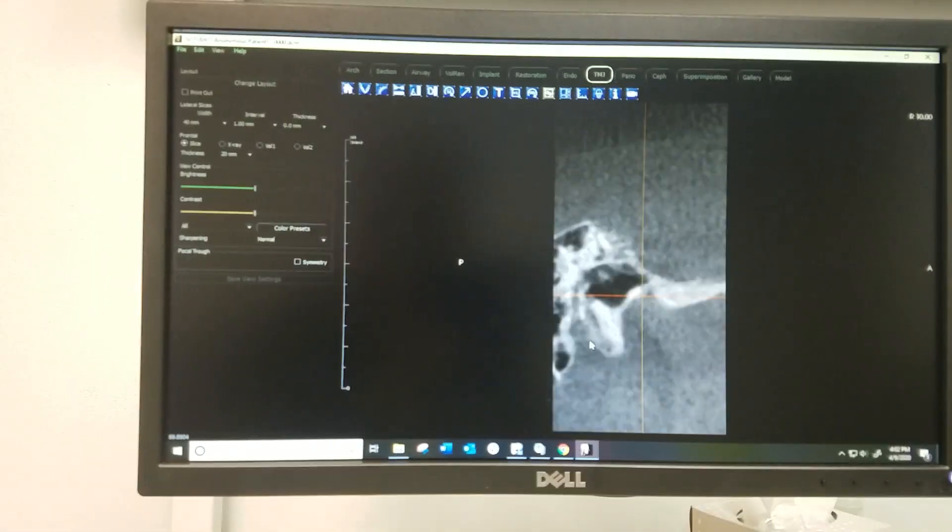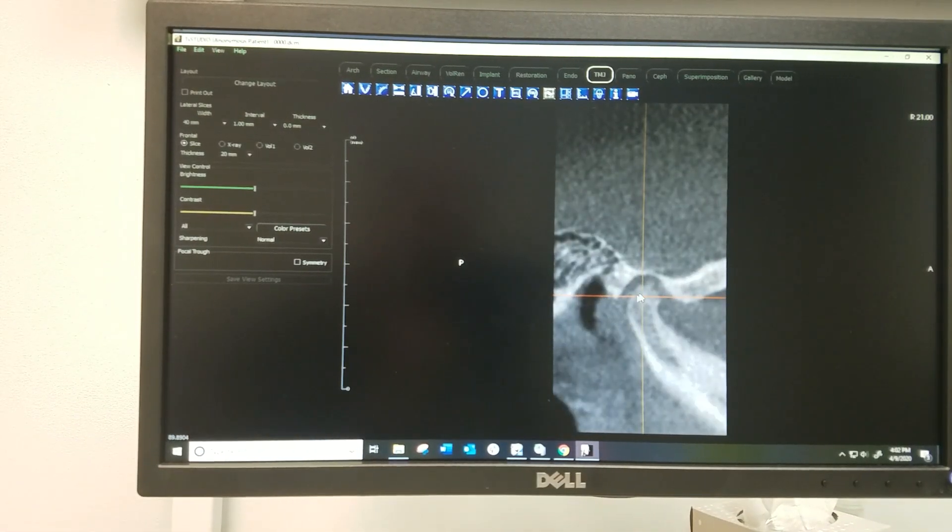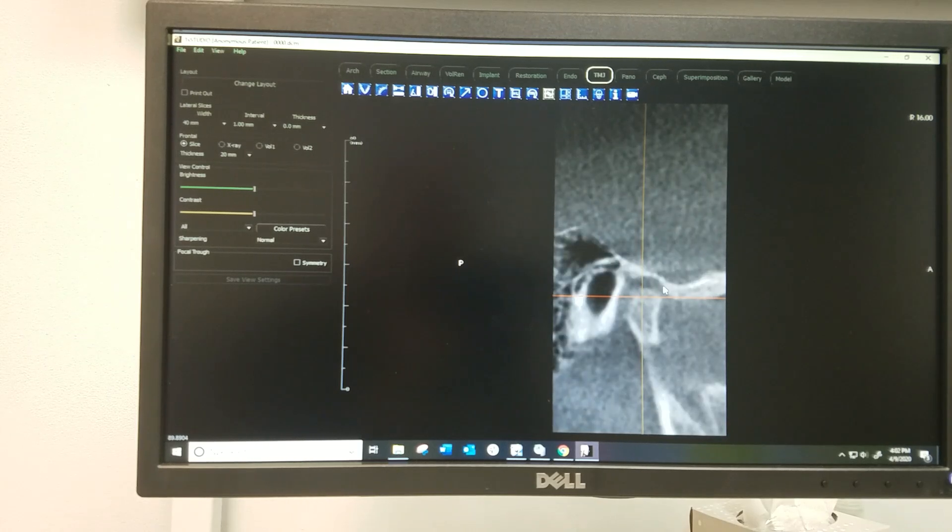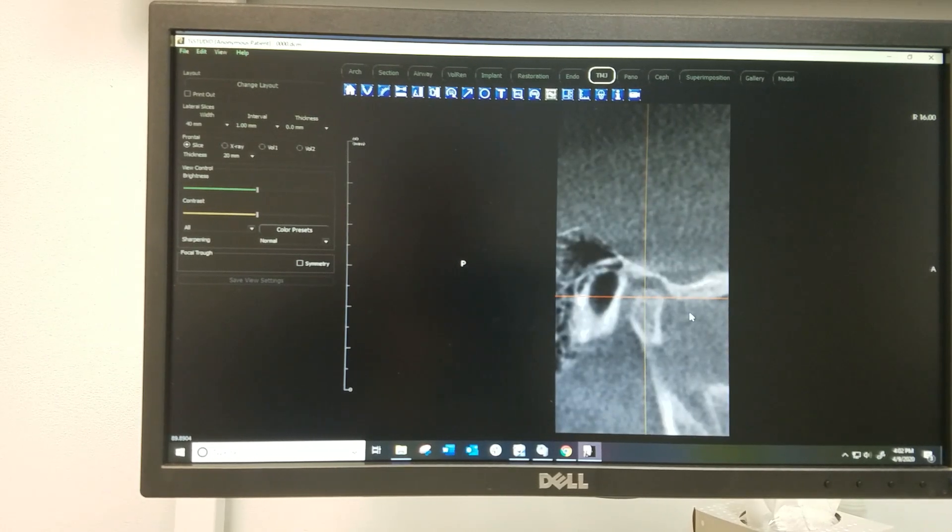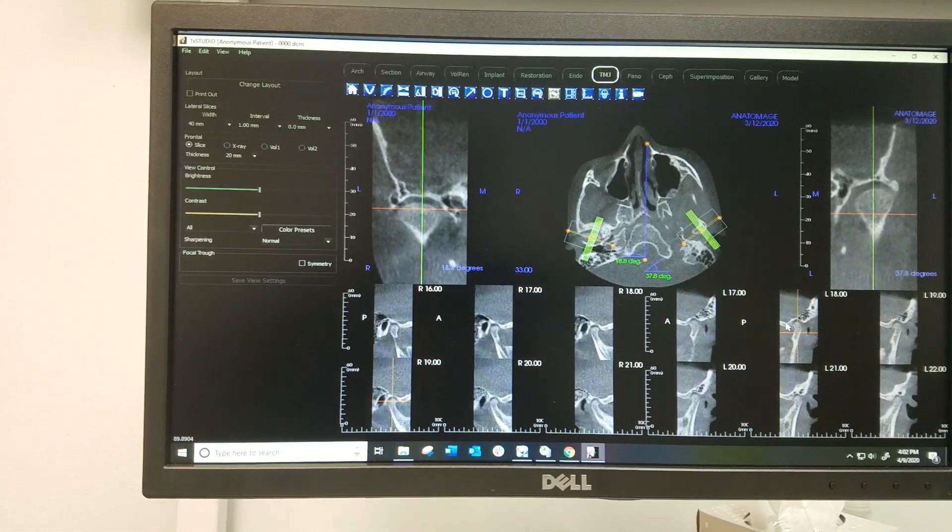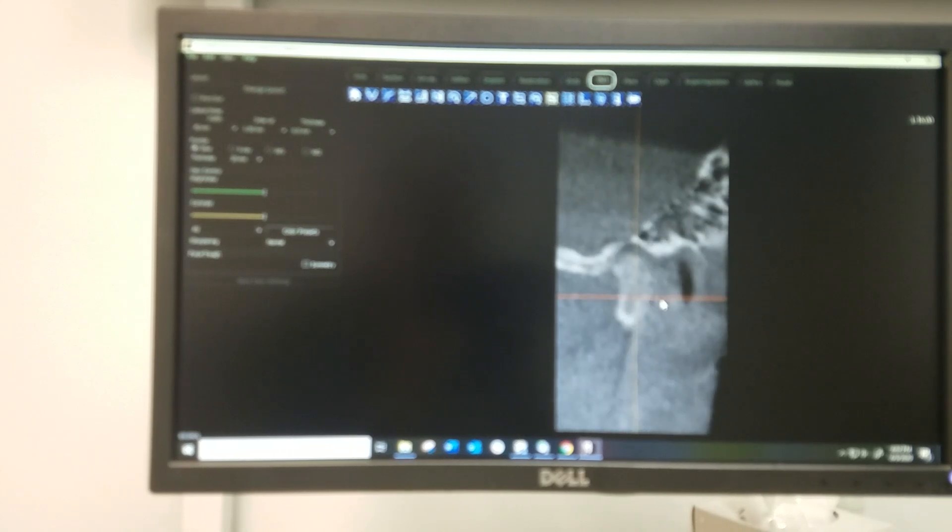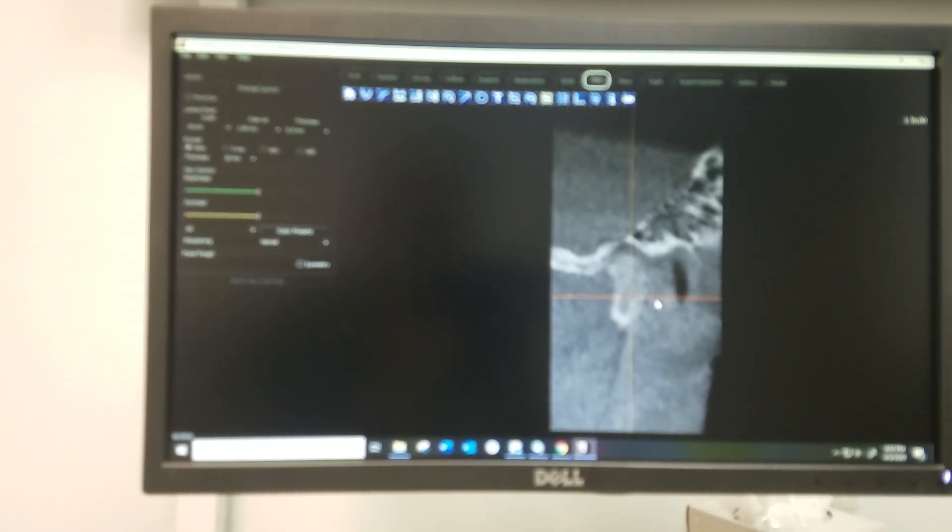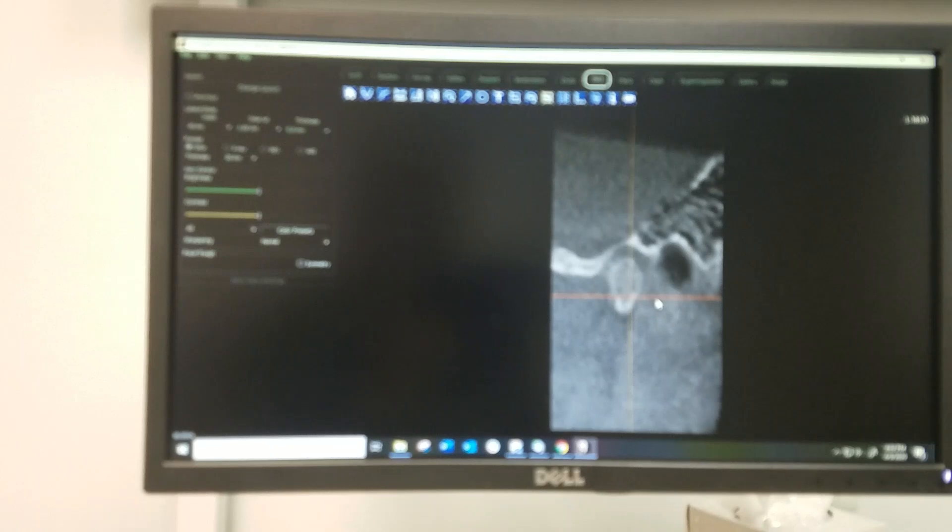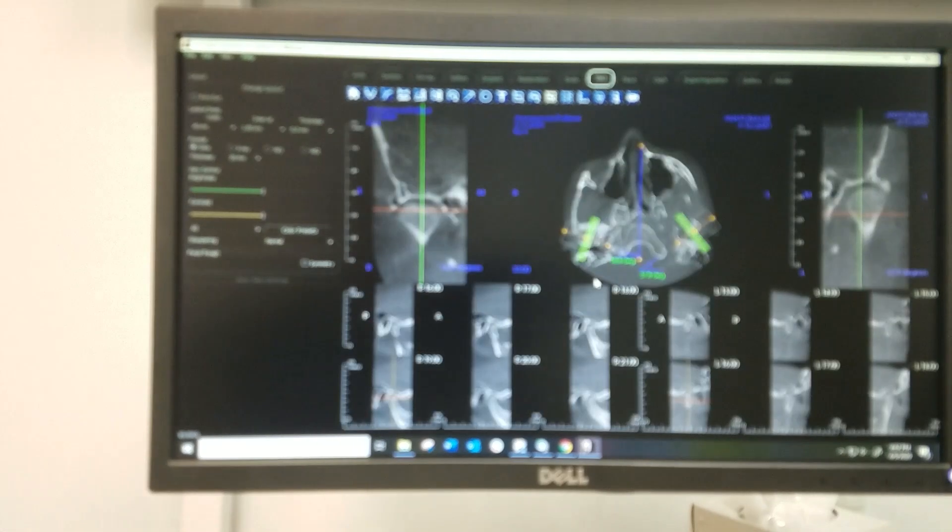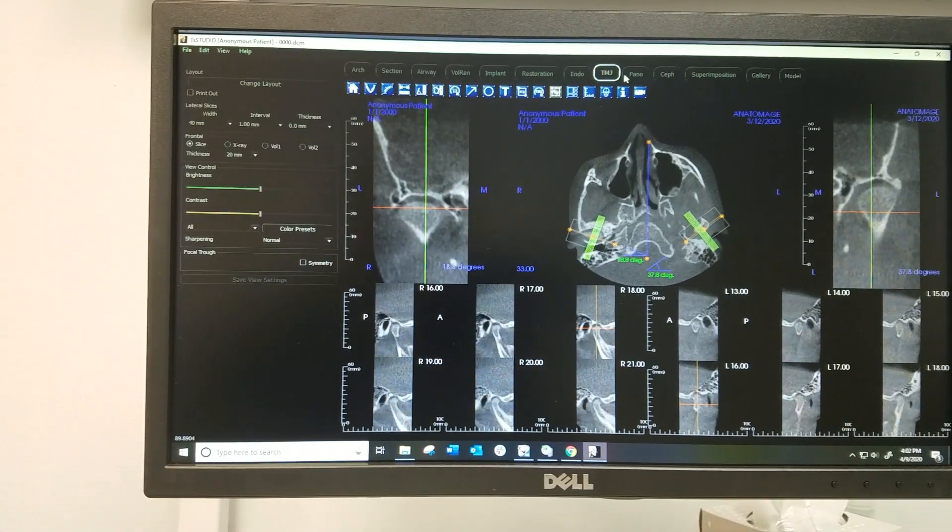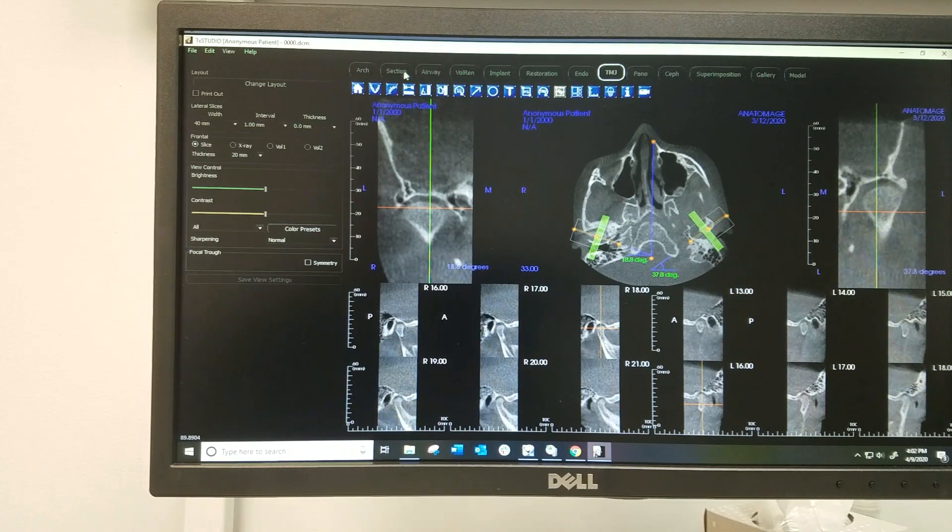Here again, this is from the sagittal view. We can see that they're nice and rounded here and that they're fairly centered in this fossa where they should be. If they were down here, that would tell me the patient is opening or he doesn't have a jaw joint that meets centric relation with intercuspation. That's way more than we want to get into here, but look at this jaw joint - it looks like it shifted down a little bit further down the eminence, so he might have a shift in his bite there.